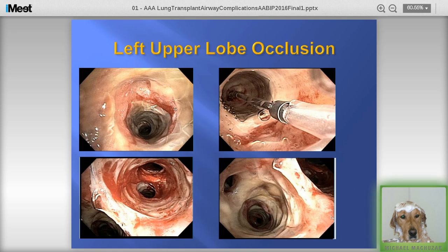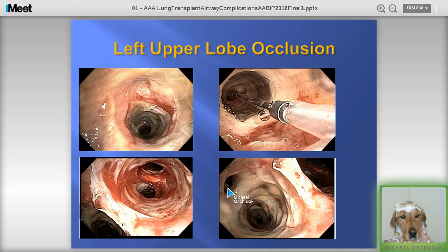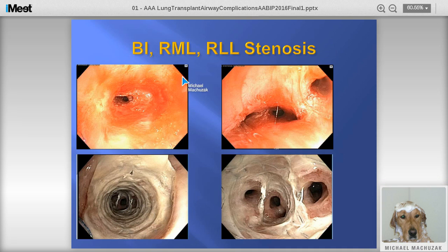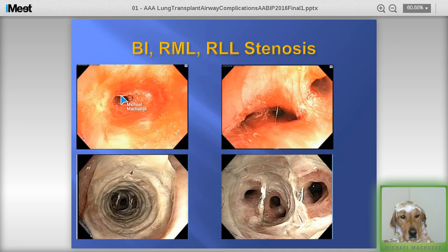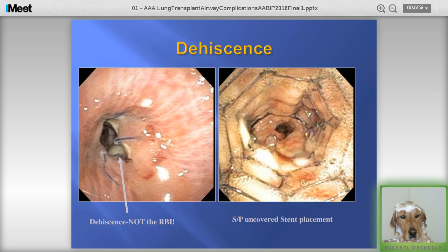The left upper lobe and sub-segments were often taught as useless to try to salvage, but as the iCAST paper will show, patients have significant improvement. Here the distal left main stem is shown — where the left upper lobe should be, it's completely occluded. After some effort, it was recovered, balloon dilated, and a stent placed. We can now see the apical posterior and lingula. The bronchus intermedius example: a very tight bronchus intermedius, chronically scarred right middle and right lower lobe, and sub-segmental involvement. We'll show a video of the iCAST stent technique.